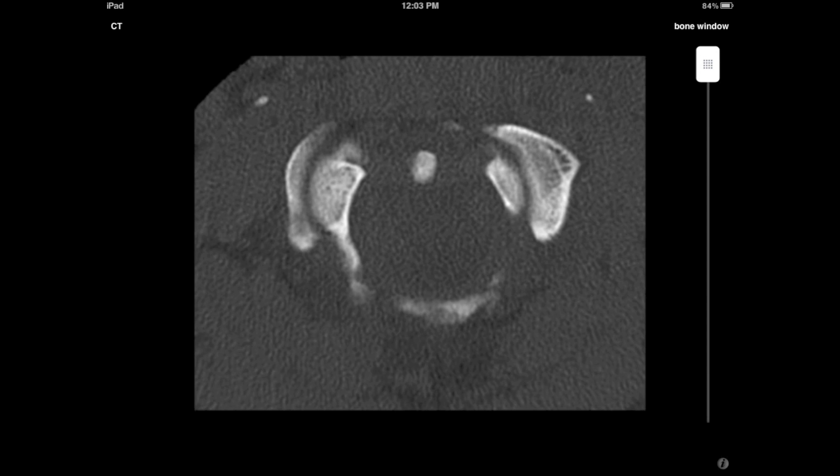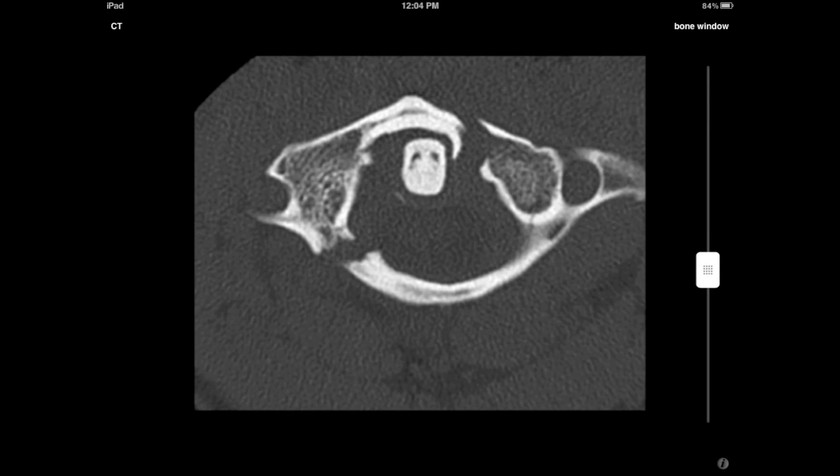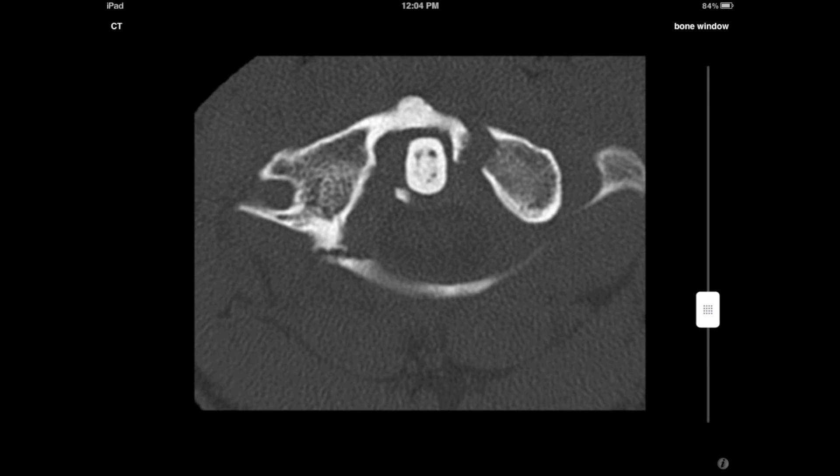Now the only way that can happen is if the arch of C1 is broken in two spots. You can see here on the CT that that is in fact the case. We can clearly see a fracture line both through the posterior arch and a fracture line here through the anterior arch.